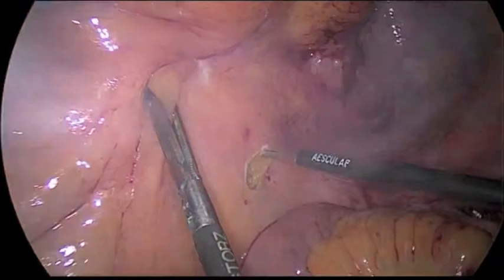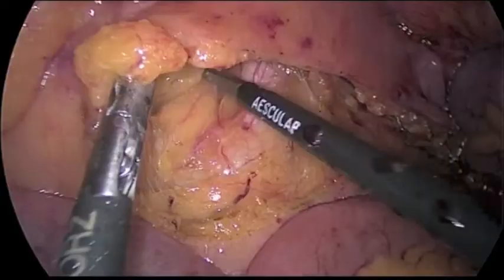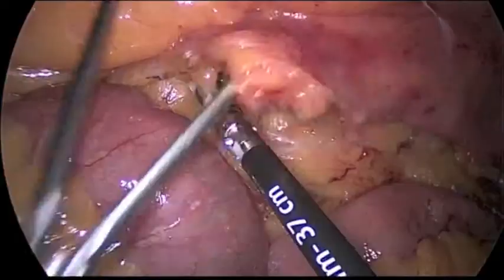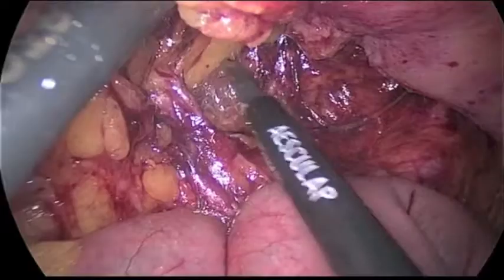A medial to lateral dissection was performed. The anatomy and ureters were identified and protected. The vascular pedicle was skeletonized, then divided with the ligature.